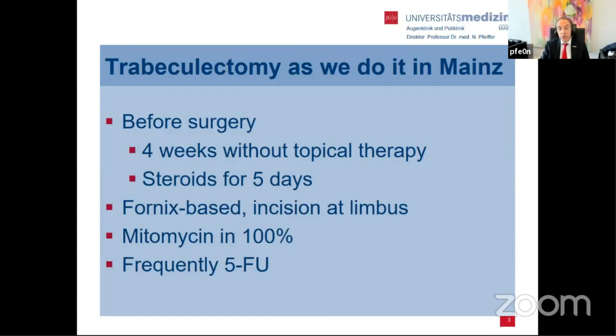Now, when you do that, you must have a technique to render a watertight suture, a watertight wound closure, and I'll show you how in a minute. I have been using mitomycin C in 100% of cases since it was available. But also frequently, I give additional 5-FU, so I'm playing hard.